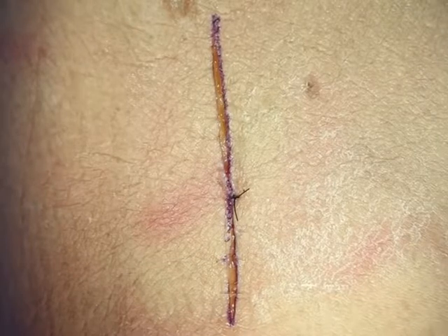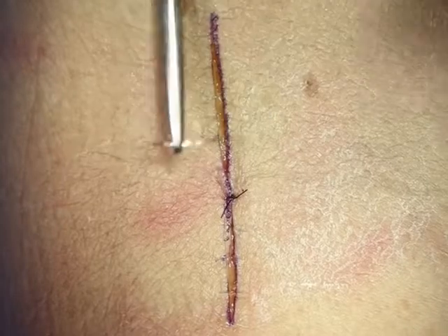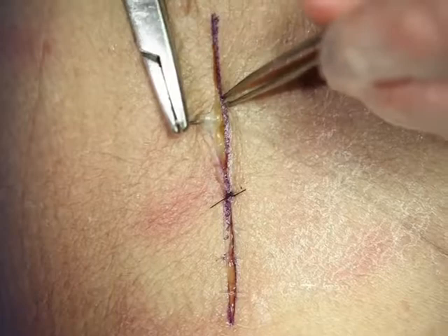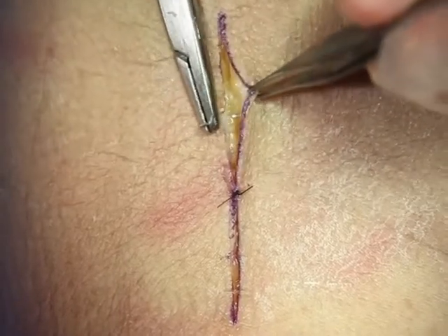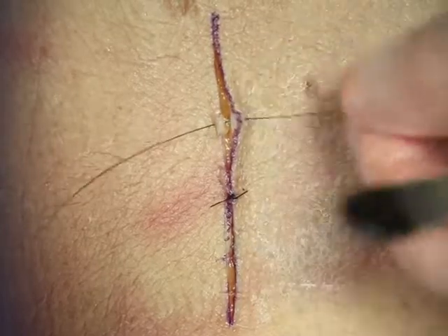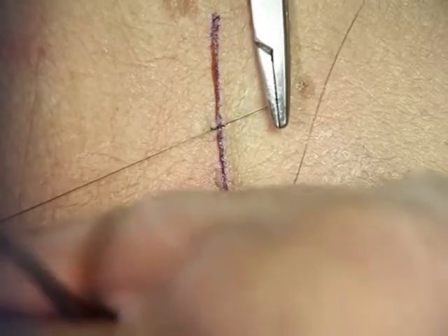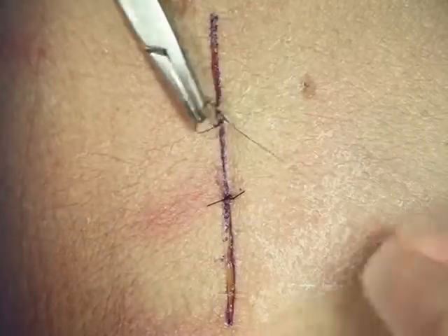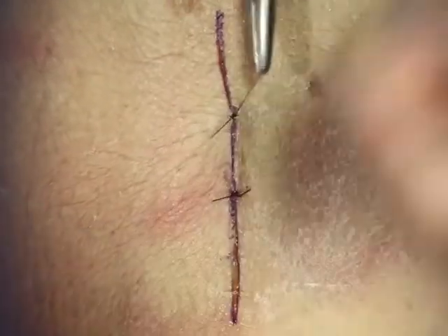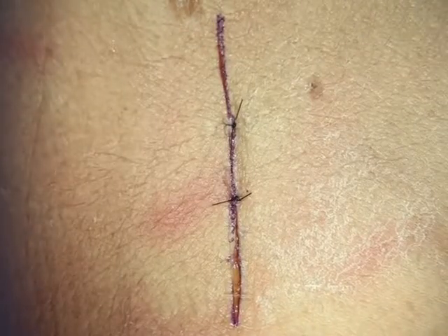This is approximation without tension. You want to go back a couple of millimeters for each bite. If the angle is off, it'll tend to invert the skin, and we want to avoid that. Exaggerate at 90 degrees on each side and make sure that you are back the same distance on each side. With an instrument tie, do a surgeon's knot for the first throw, cross the suture over, lay it down nice and flat. Don't pull up on it until you get the second suture down, tighten it, and lock it in. This is the simple suture — it's something you'll need to practice a lot to master.